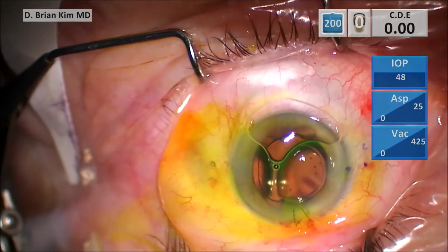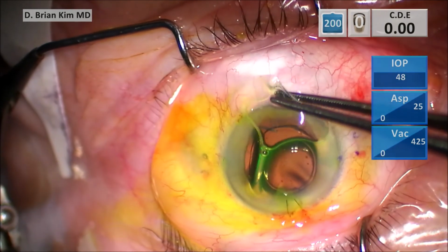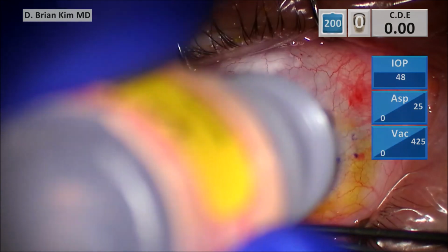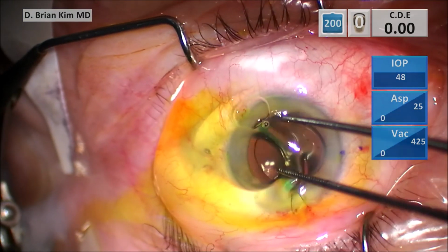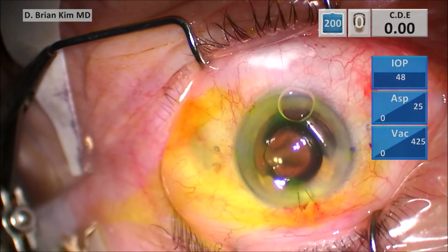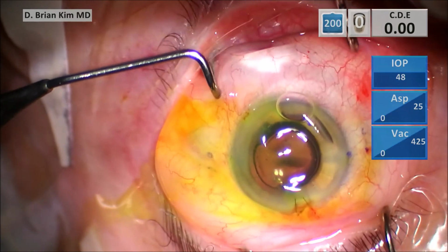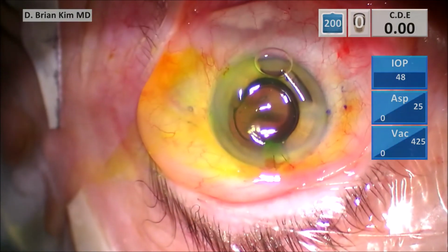And again, the biggest take home with this case was the fact that I strategically placed the trocar in the area of the zonular hinge that was still holding the lens. By placing the trocar over the zonular hinge, I was able to lift the lens up using the vitrector and then securing it and then cutting it out.